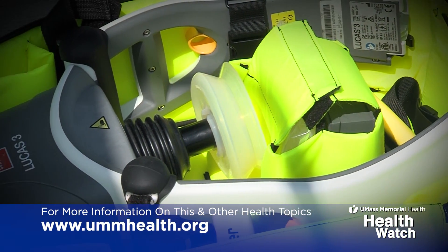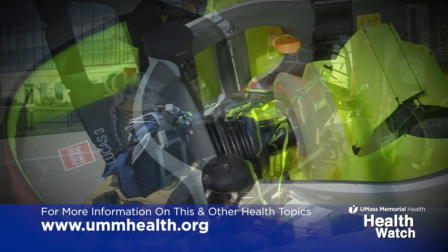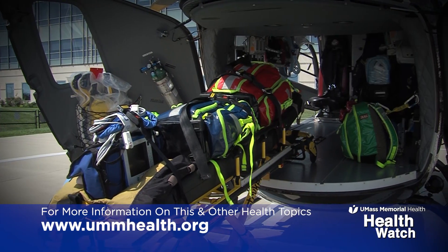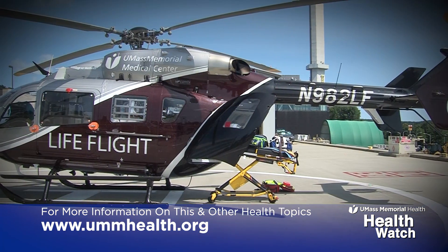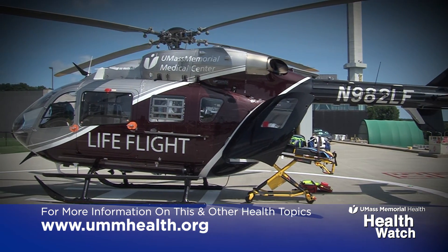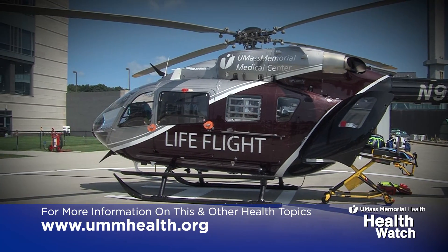Being able to put this on will allow us to remain in our seats with our seatbelts on, and chest compressions will be uninterrupted. Chest compressions by this device or similar devices that automatically perform chest compressions are more effective, with less interruptions than manual chest compressions by a person.